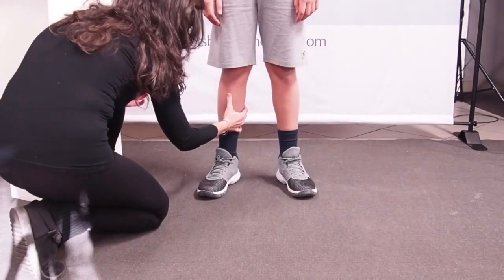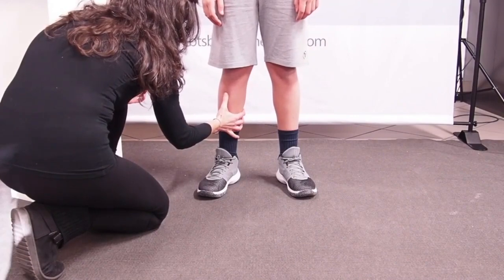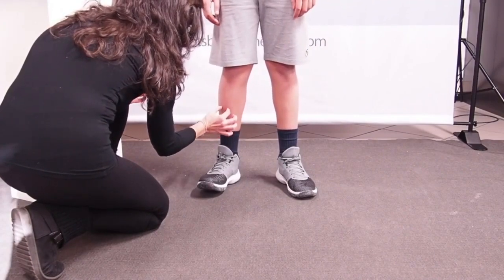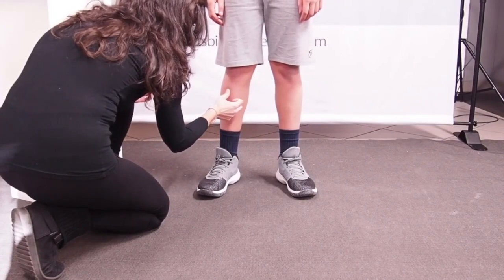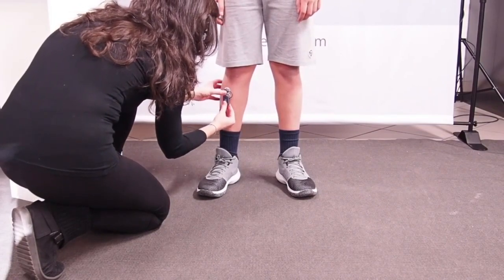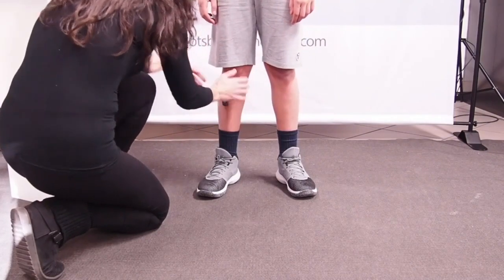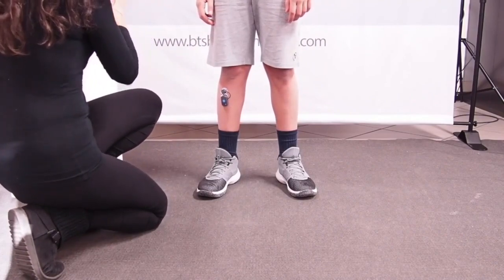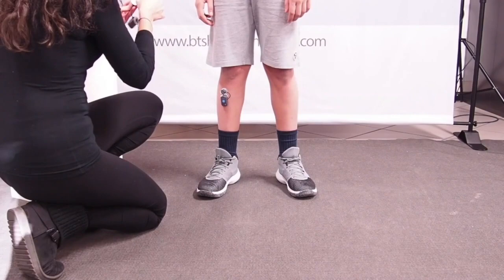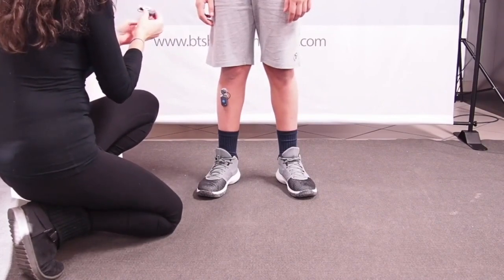For the electrodes application on the tibialis anterior muscle, let's start from identifying the tibial crest and slightly move in lateral direction. If the patient is able to perform it, we ask him to go into dorsiflexion with the ankle, so as to identify the muscular belly well. The electrodes are placed parallel to the direction of the muscle fibers. With a light pressure, we make the electrodes adhere well to the skin. We repeat the same procedure on the left.